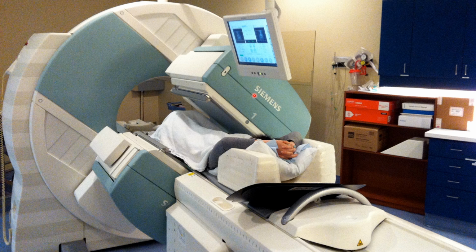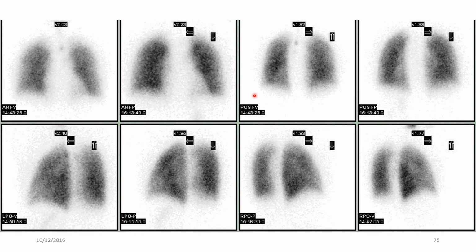I spoke to you about the lungs as well. One of the popular ones is VQ scans, although they have declined in popularity. It's not so much popularity. Nobody really wants a radiation dose, but in terms of usefulness, it's quite common. And it's called a VQ scan. And you went, what the hell is VQ? It's a ventilation perfusion scan. Don't ask me why Q stands for perfusion, but it does.